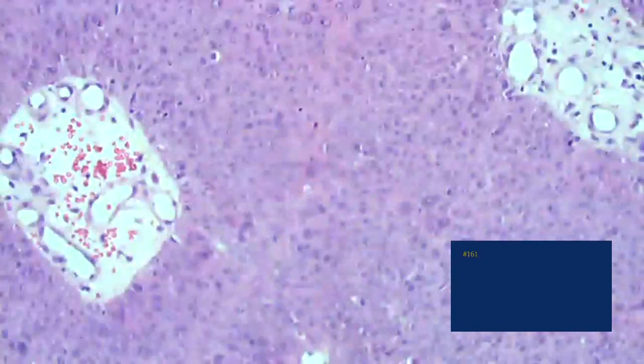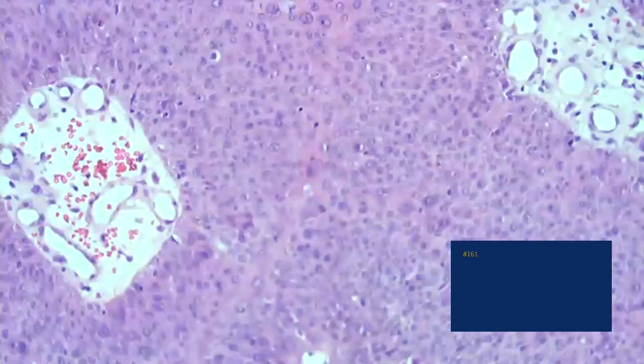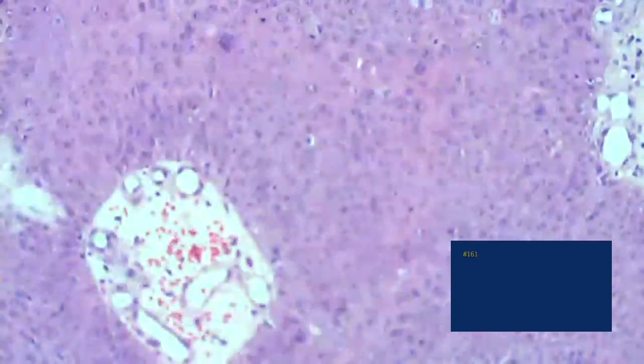So if you see condyloma, you really need to take a look at it and see if it's got features of squamous cell carcinoma in situ evolving within it. It's more commonly seen in patients that are HIV positive, really common in that setting. Clinically, it usually looks kind of like a brown cluster of papules forming a plaque. It does tend to be kind of brown in color. Here's another area demonstrating the same changes.